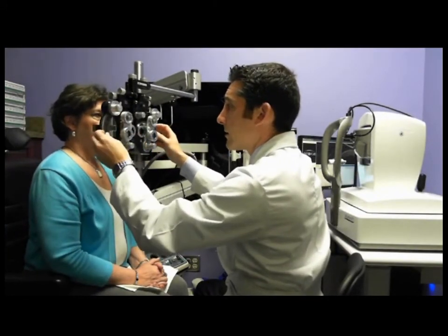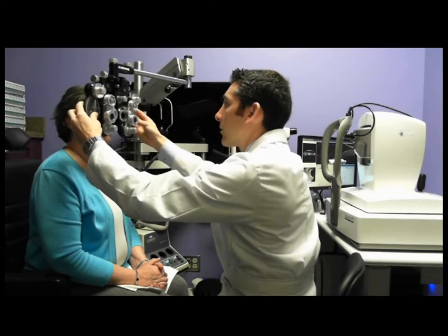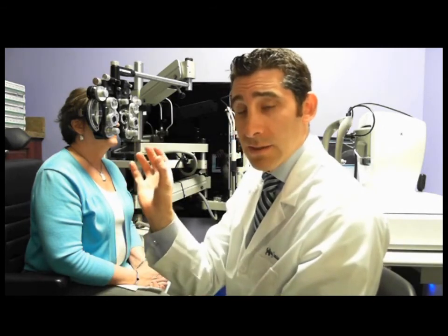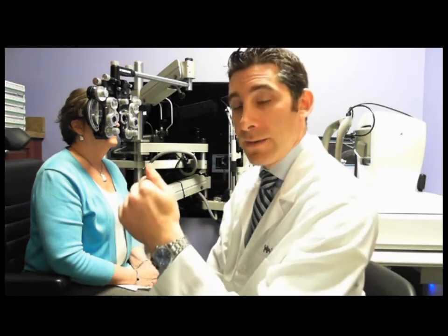But the most important thing that I'll tell you is to make sure that when you're doing your over-refraction, you do a spherocylindrical over-refraction. Because with a Europa scleral, we have the ability to stabilize it using slab-off prism. And that gives the ability to put a spherocylindrical prescription into the lens. You can maximize acuity much, much better. So you can eliminate corneal astigmatism just with the post-lens tear reservoir, but you can eliminate internal astigmatism with a spherocylindrical refraction on the front surface of the lens.